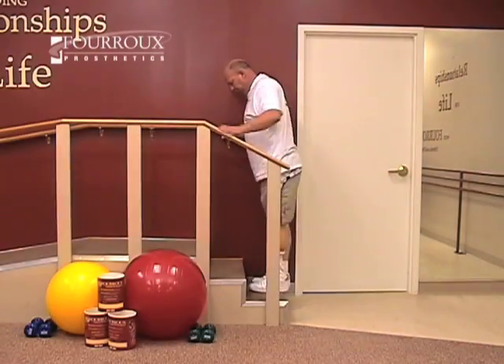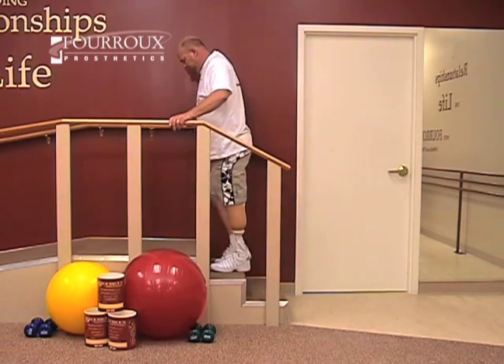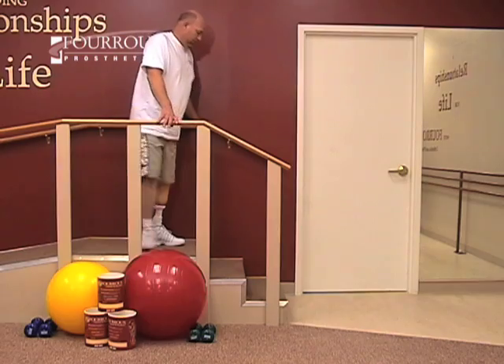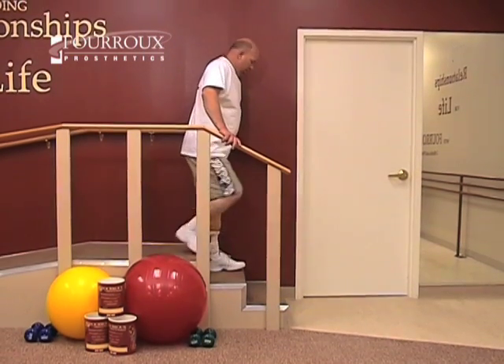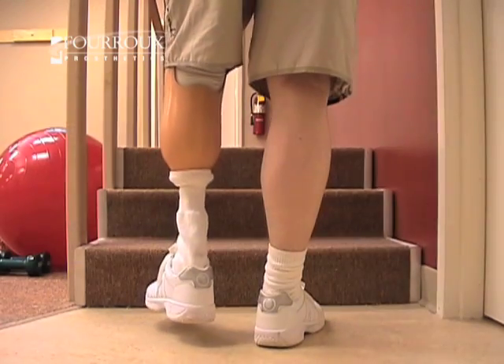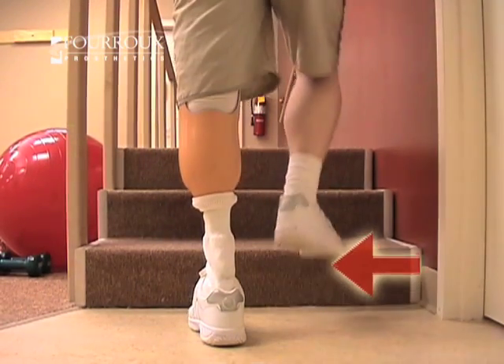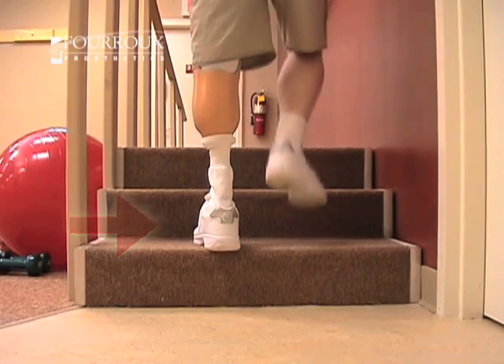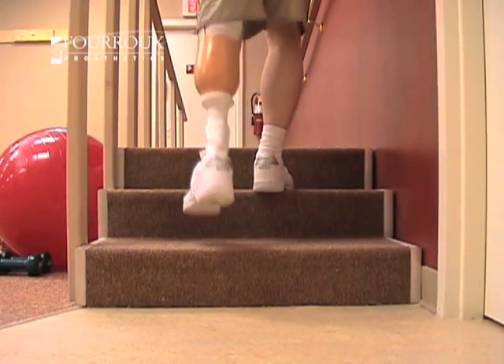This method of walking stairs is called a step-to pattern, and it's primarily for above-knee amputees. Whether going up or down stairs, focus on controlling your residual limb. When stepping up, start with your sound leg, then bring your prosthesis up to the same step. Repeat this for each stair.